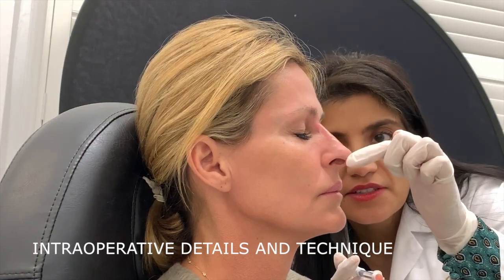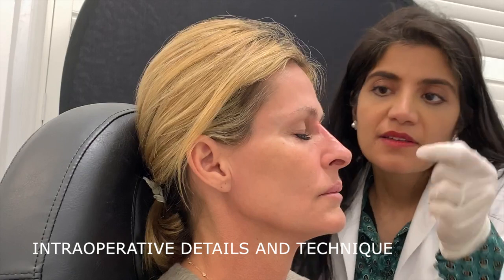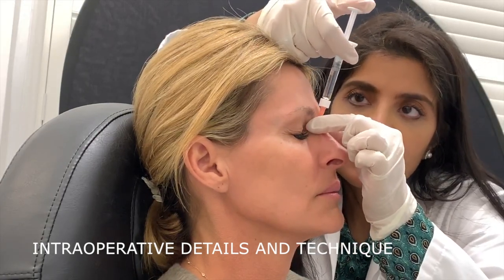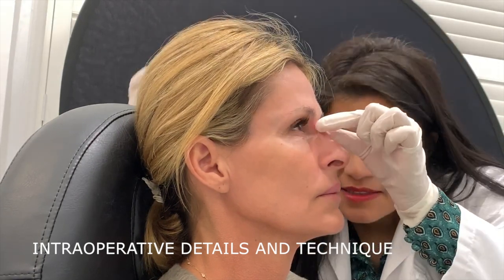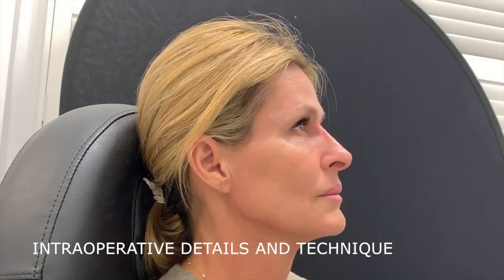When speaking to patients about non-surgical rhinoplasty, it's important that they understand the limitations of the procedure, including that we are not removing any bone or cartilage or placing any permanent sutures. Indeed, this technique is more of an optical illusion that improves the nasal contour by improving the light and shadow reflexes on the nose. Non-surgical rhinoplasty is one of the most popular and frequently performed minimally invasive injectable procedures in my New York City private practice.